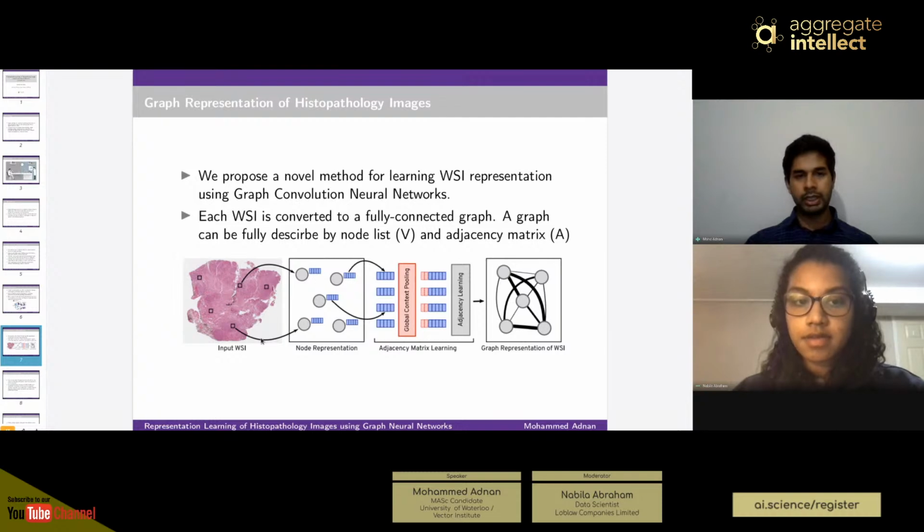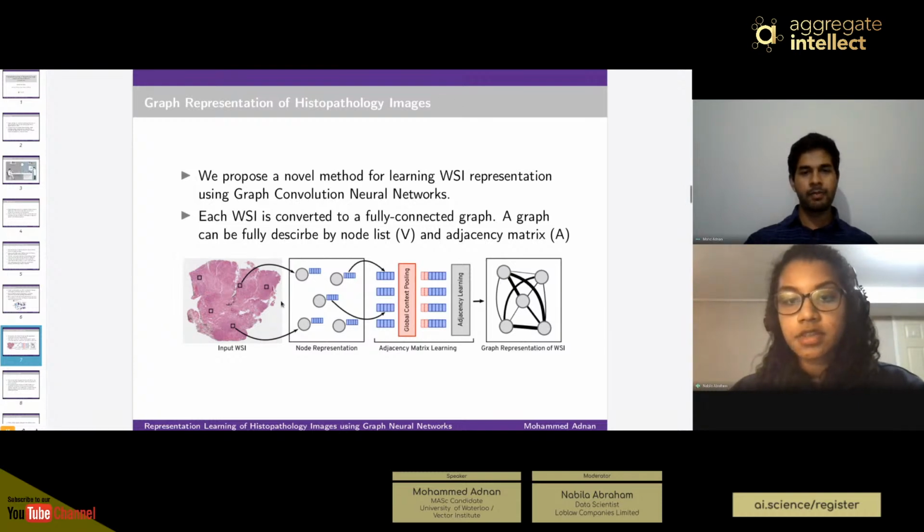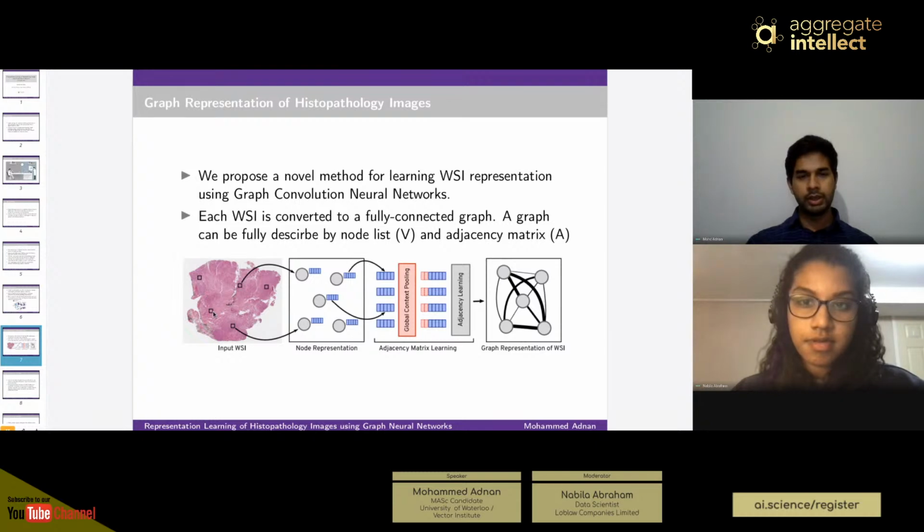And it could end up learning spatial relation if that's the case. Okay, so in the perfect scenario, you would want it to learn importance to neighboring patches and not actual spatial structure? Yes, that's right. Okay, cool. Because I have a cancer patch here and a cancer patch at the opposite corner. Definitely they are more connected than the neighboring patches. And that's why we don't want to use spatial information as a prior for the adjacency matrix.